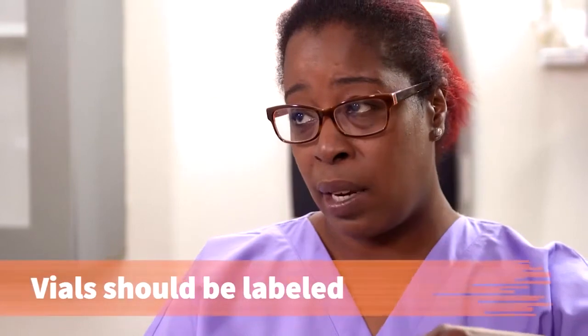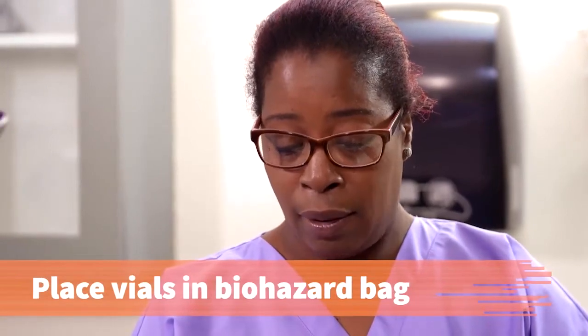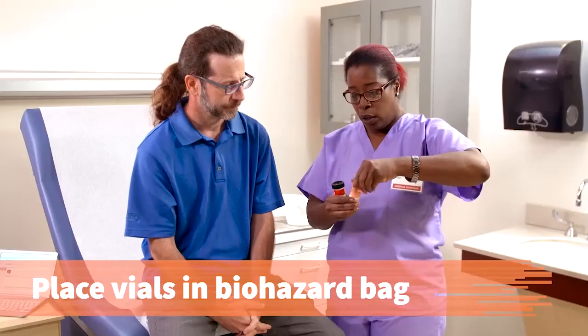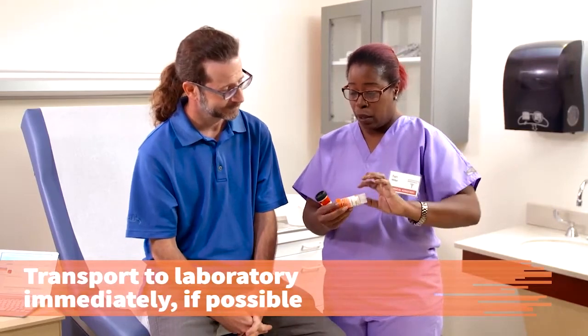The vials should be labeled, placed in a biohazard bag with a zippered closure, and transported to the laboratory immediately if possible. When you are done collecting the samples, you need to make sure that you are putting your name, date of birth, all your information, and also the date and the time that the sample occurred. Okay. You're going to put that on each one of the samples.